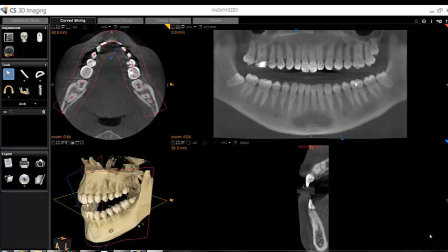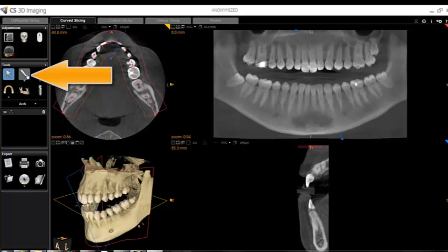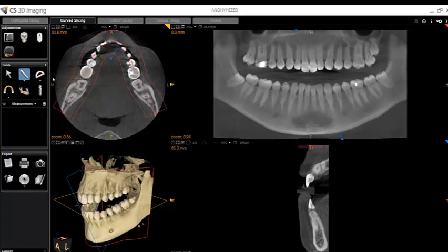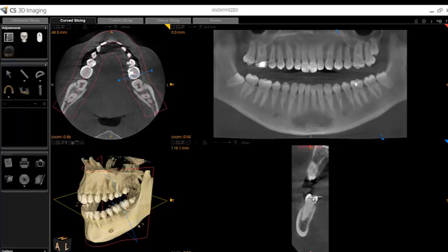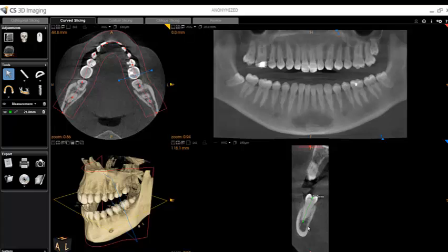From here, you may identify a point where you would like to do a measurement. Please remember, all measurements done on your patient's CBCT scan are one-to-one measurements and require no calibration. To do a linear measurement, single-click the ruler tool in the toolbox. Move to the slice where you would like to take your measurement, do a single left-click at the first point, then a single left-click to complete the measurement. The same will apply for a width measurement.